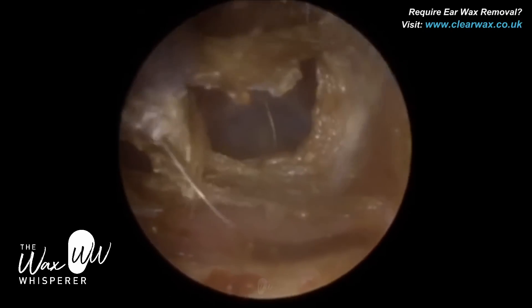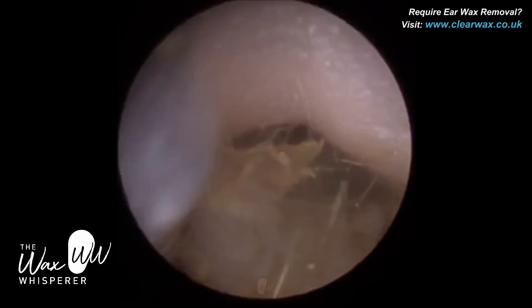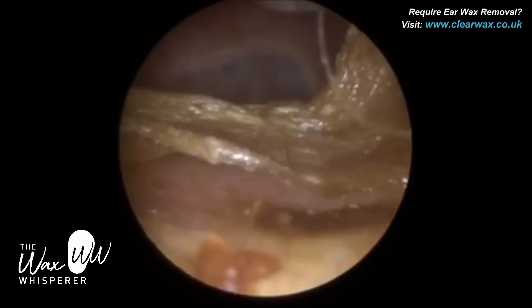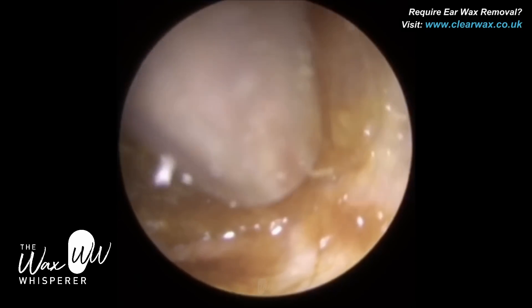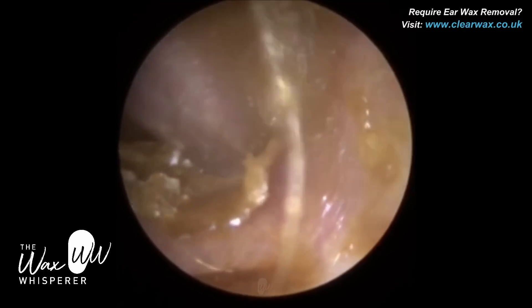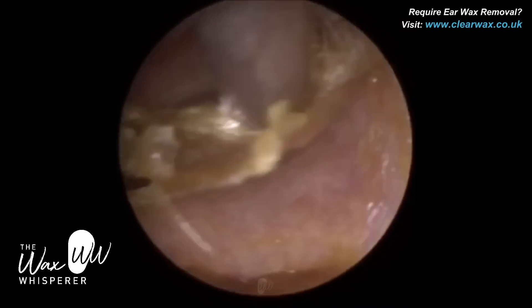So again, we've just got a bit of keratin here. Now, this patient's ear canal is quite inclined. Everyone's ear canal — the average upward inclination is about 30 degrees. This patient's ear canal does incline a bit more than 30 degrees, so a bit more than normal.